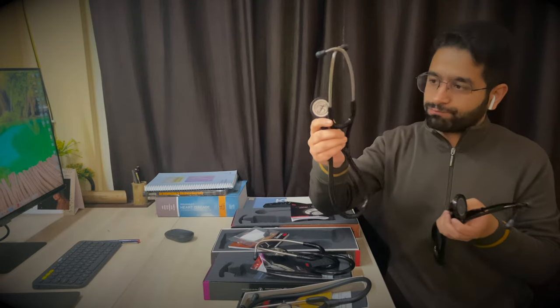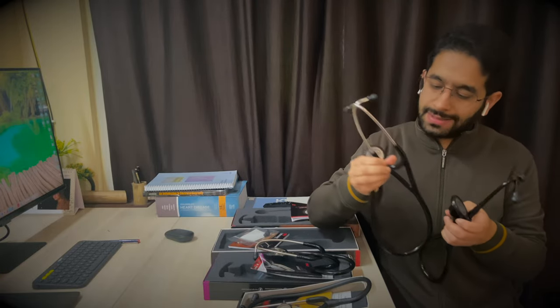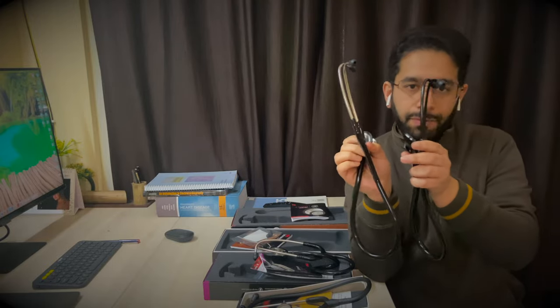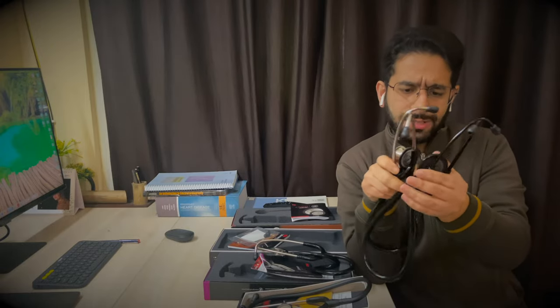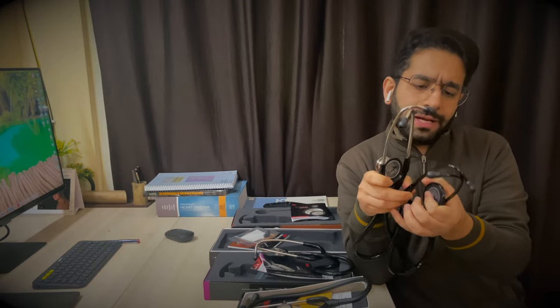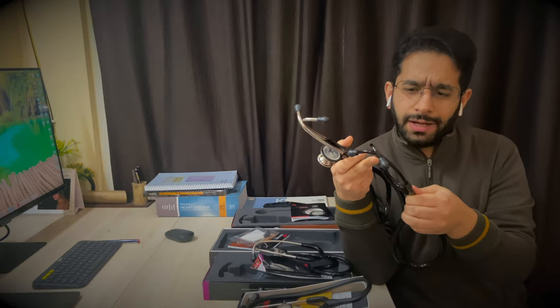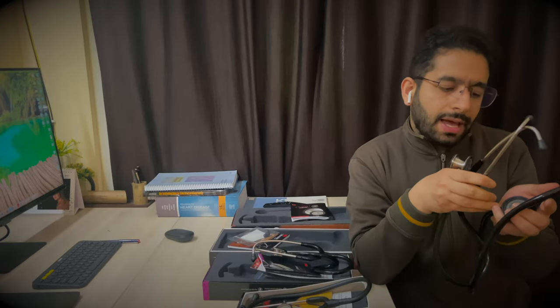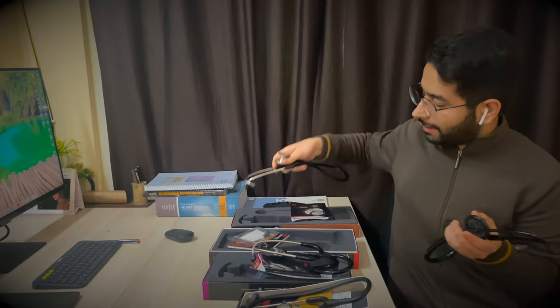The Littmann Cardiology 4 has an adult diaphragm on one side and a pediatric diaphragm on the other. It also has wide double lumen tubing and performs equally well as the Master Cardiology. These cost around 16,000 rupees for the stainless steel version. This black plated version costs around 18,000 rupees, and different colors are available.